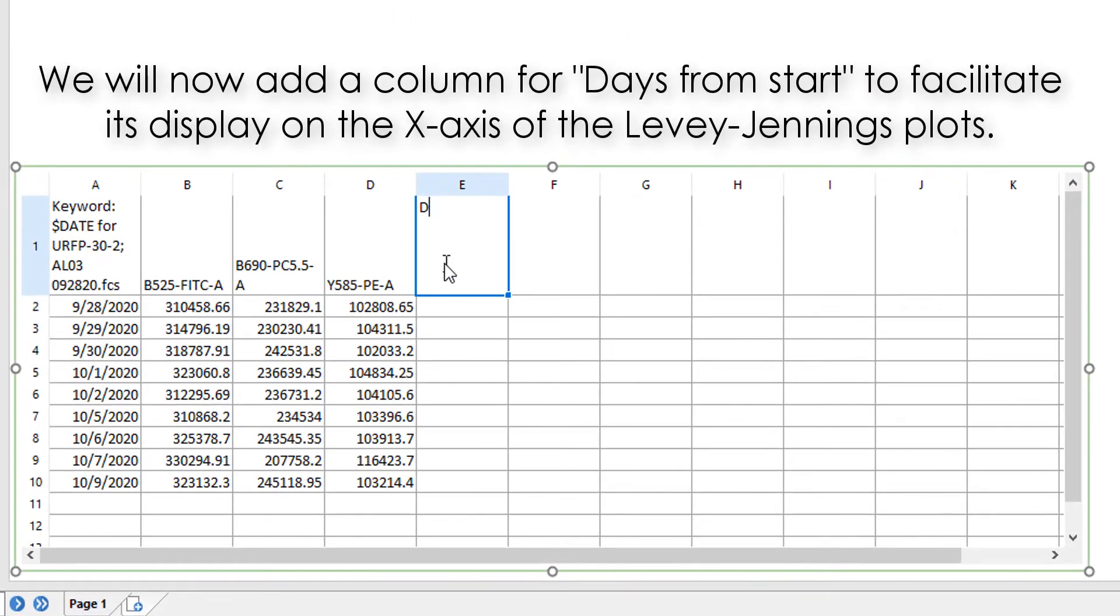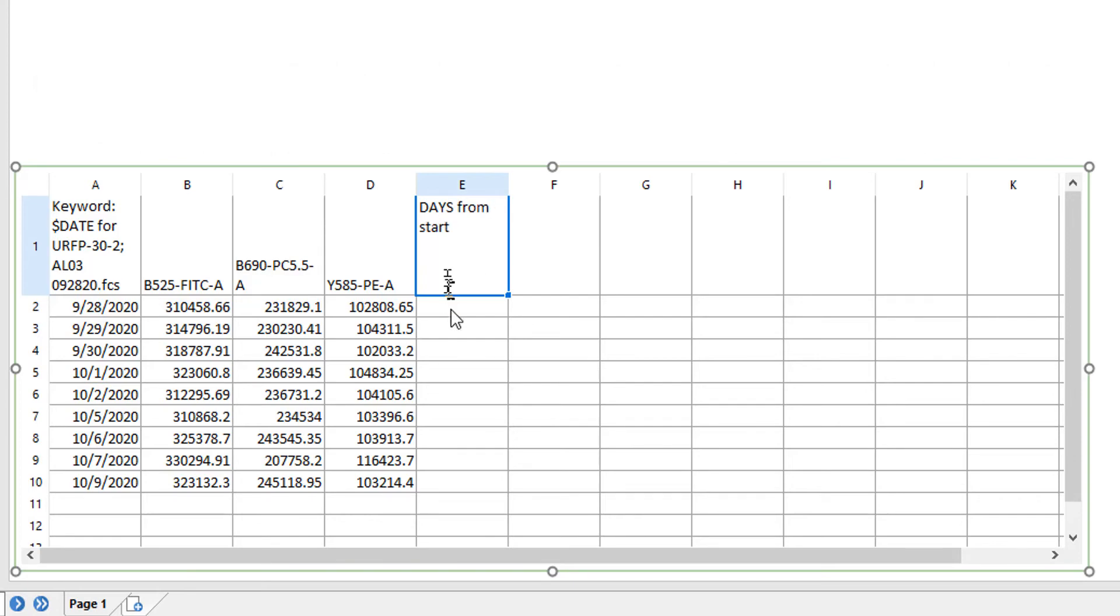Add a column for days from start to facilitate this being shown on the x-axis of your Levey-Jennings Plots.